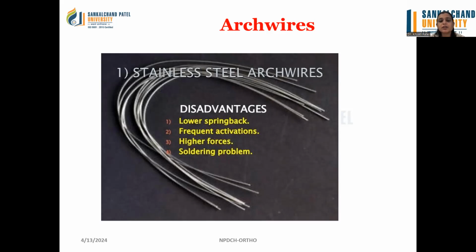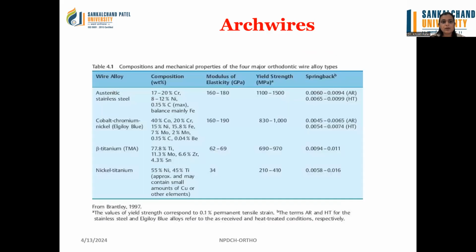Even frequent activation is required due to lower springiness. They deliver higher force, and sometimes there is a problem in soldering with other metals. So if we look at this table, you can see there are different types of arch wire.